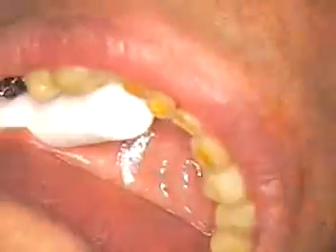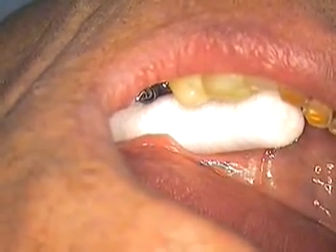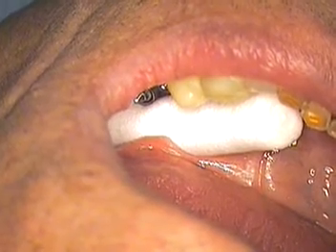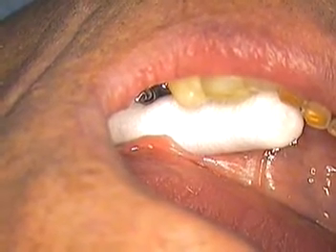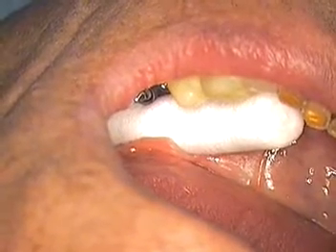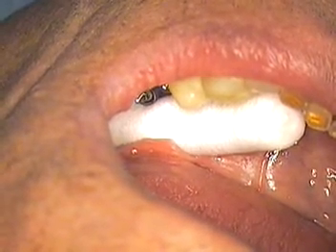It's very close to hand tightening. Someone said they did studies on hand tightening and they found out that the average was 16 for hand tightening. So we're just going a little bit beyond, almost like a nudge. We're just nudging the needle just a little bit further from that.